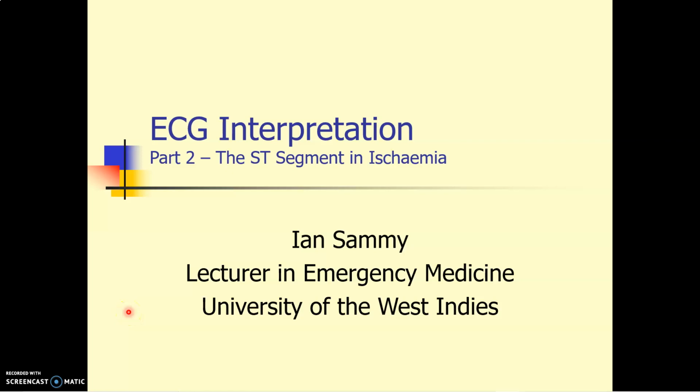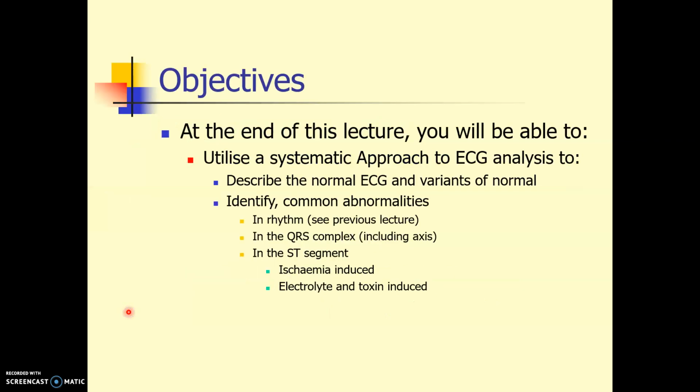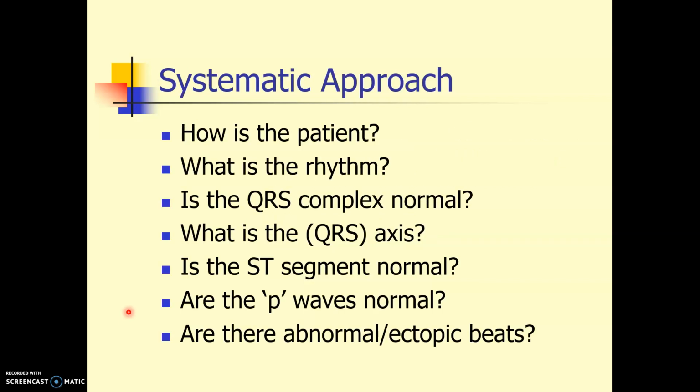This second lecture in our basic ECG series will focus on the ST segment in coronary ischemia. At the end of this lecture, you will be able to identify common ST segment changes induced by coronary ischemia.